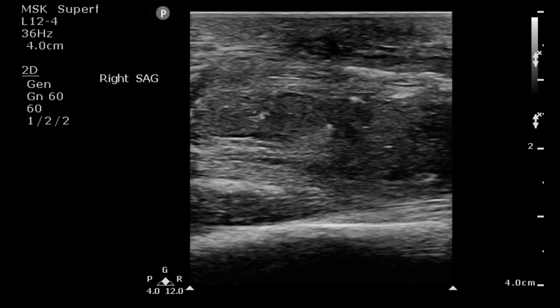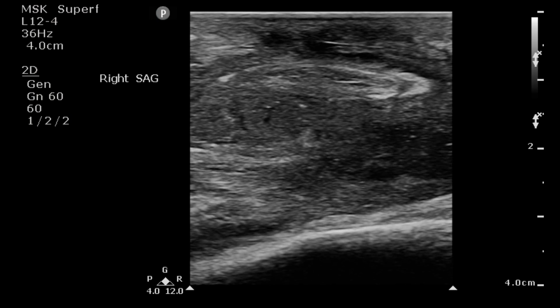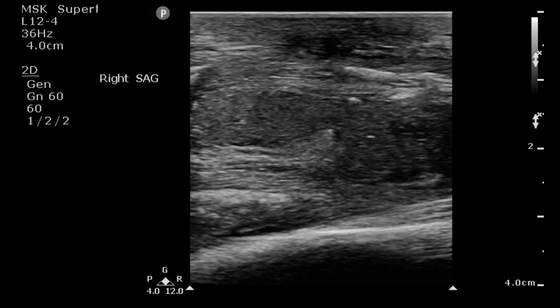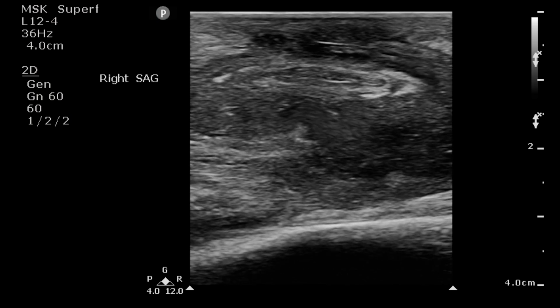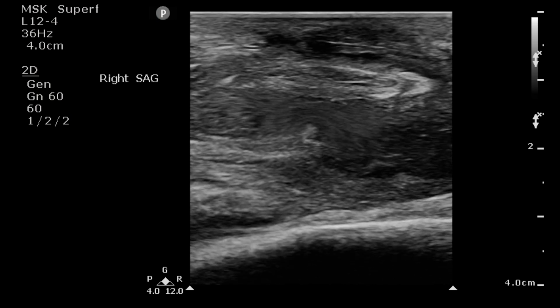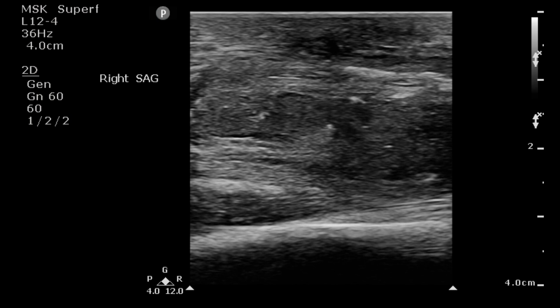So there's different ways you can apply that, and I haven't really seen a ton of literature that looks at some of those nuanced secondary findings. But I think there's a huge benefit of ultrasound in those particular places to look for the secondary things that we want to know about an abscess, not just is the thing there, right? So end of rabbit trail. Let's get back to our slide.